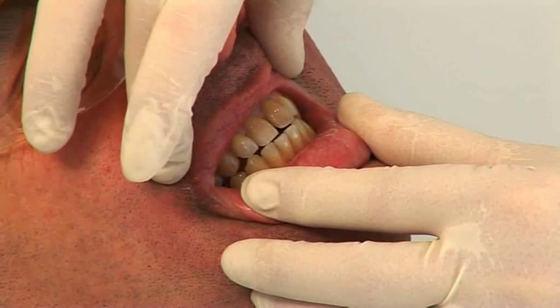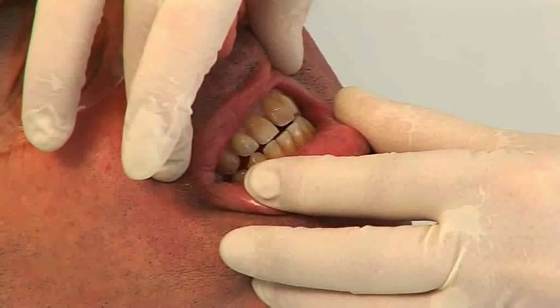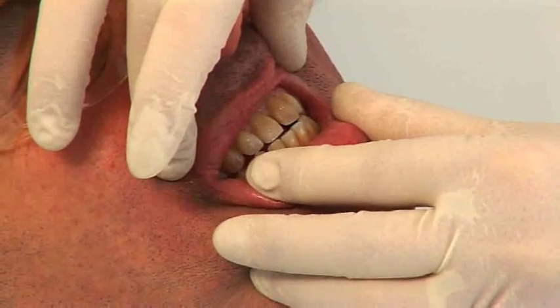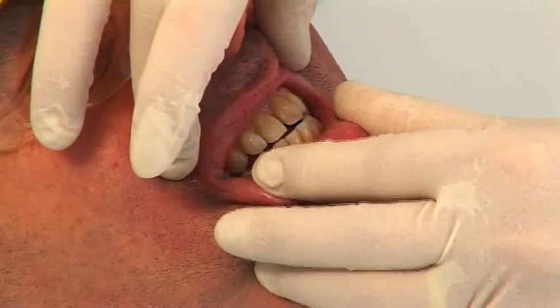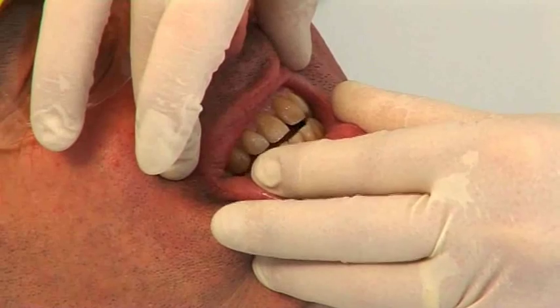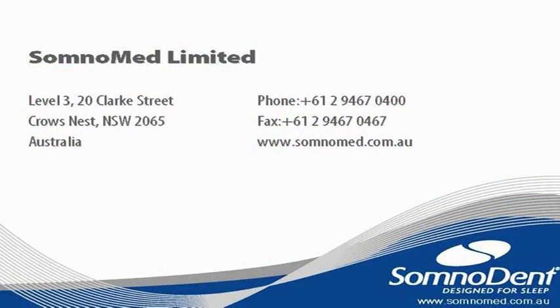Simon, could you please tap your teeth together and just get a feel of how the teeth touch at that position. So when I put the George Gauge in, we'll be working at around a position that's similar to that, but not the very far forward position. So go back to your normal bite now.